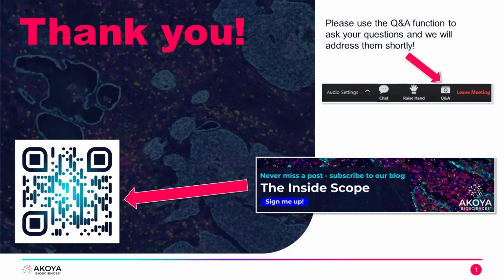Are we able to stain the tissue again at a later time? For example, a month later, if you decide to look at different proteins, or do we need to decide from the start? So you would need to decide your panel. You're able to do subsequent H&E and other types of histological stains after the Codex experiment is done, but for your actual panel of markers, whether you're using 4 or 40 markers, those need to be decided ahead of time. So you're not able to restain once you've done the full Codex staining protocol.